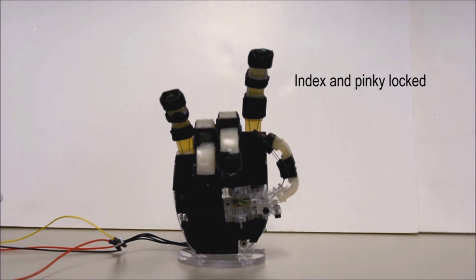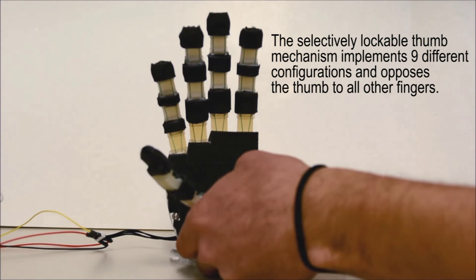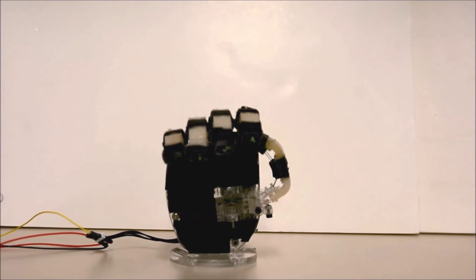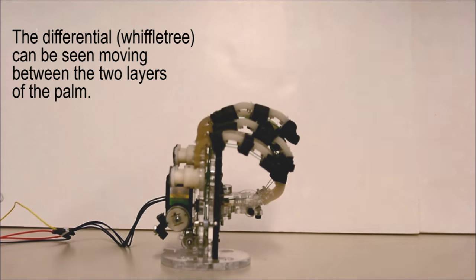A common cause of cost explosion in commercially available solutions is design customization. To address this need, without compromising affordability, we use parametric hand models derived from hand anthropometry studies to adjust our design to the needs of each individual. The only required parameters to personalize the design are the hand length and the hand breadth.